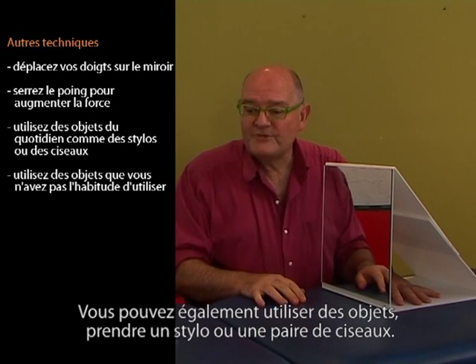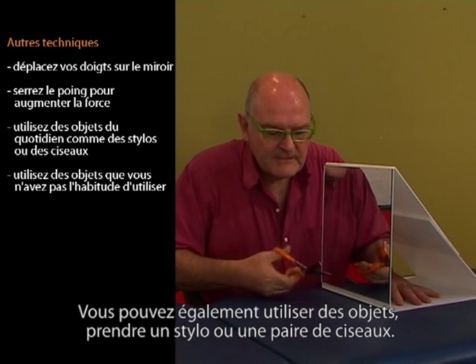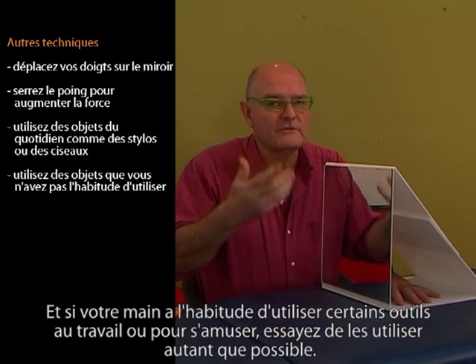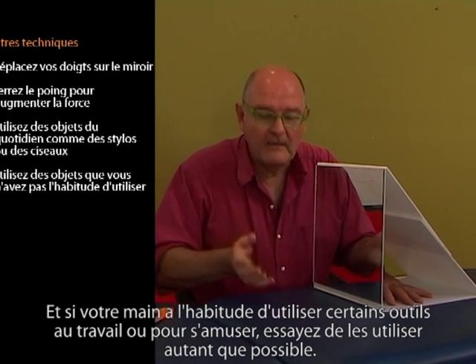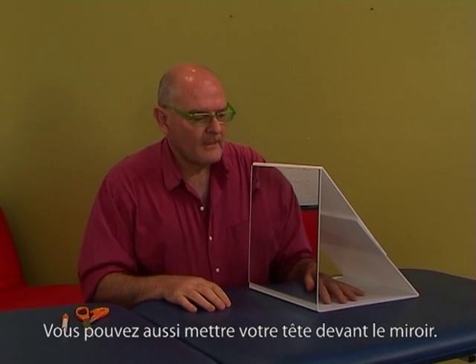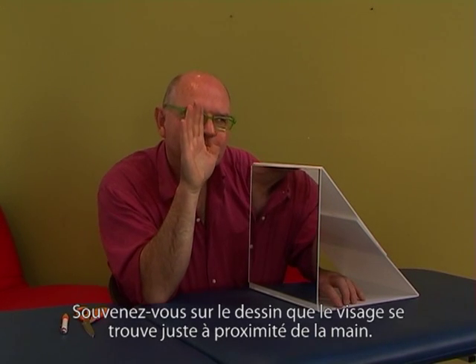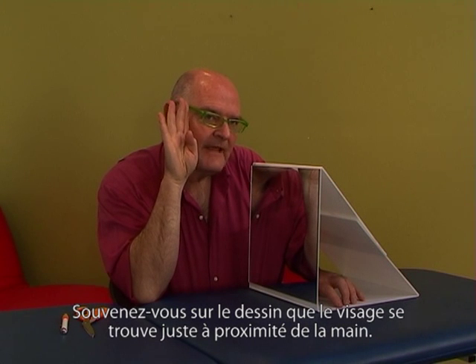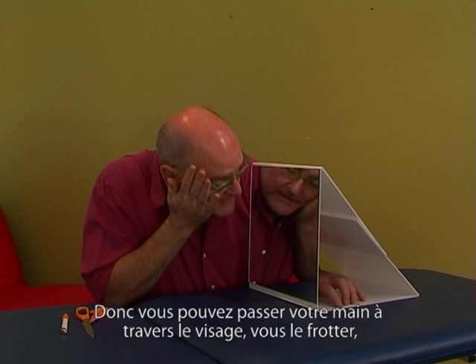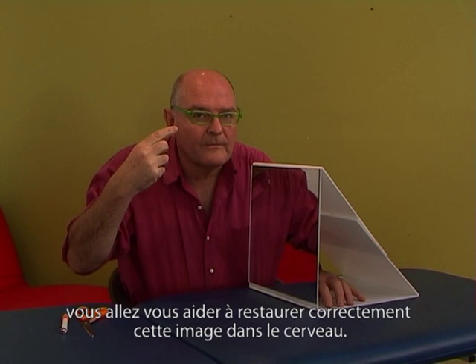You could also use objects. Get a pen, get a pair of scissors. And if that other hand used to use a certain tool at work or at play, try and use that as well. You can also take your head into the mirror as well too. Remember in that little drawing that the face is next to the hand? So if you can bring your hand and rub your face, go across your face, you're going to be helping to restore that little image in the brain as well.